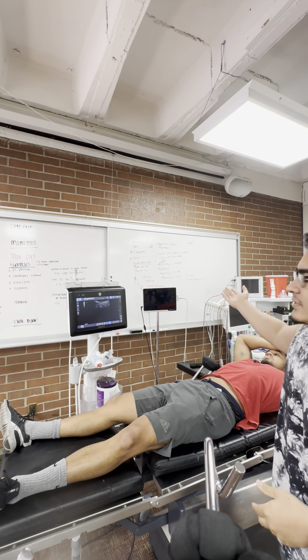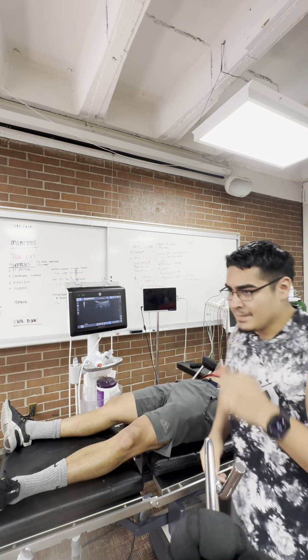All right, hello everybody. Today we're going to be doing a PENG block as well as a left IJ ultrasound image. So initially, I'm going to show you my notes. Those are my notes back there. So initially, you would want to look over the patient's chart.